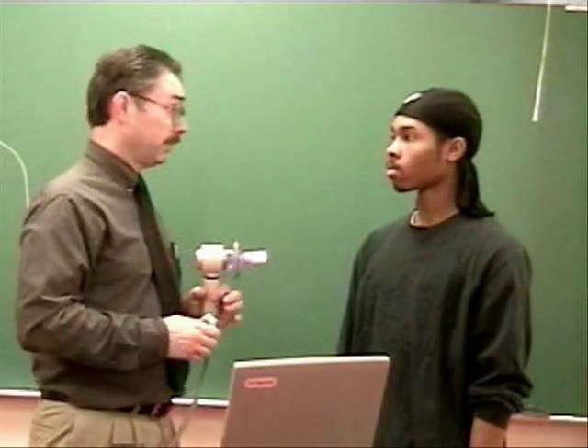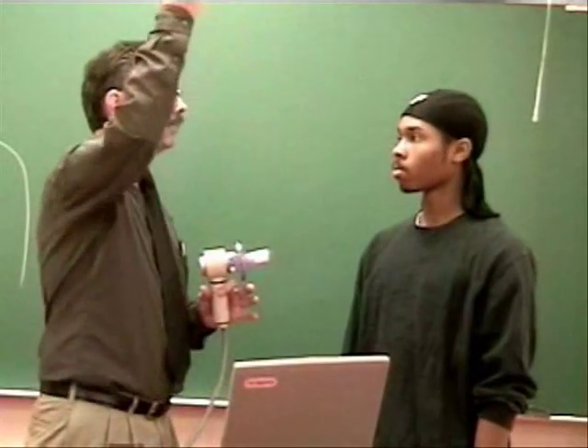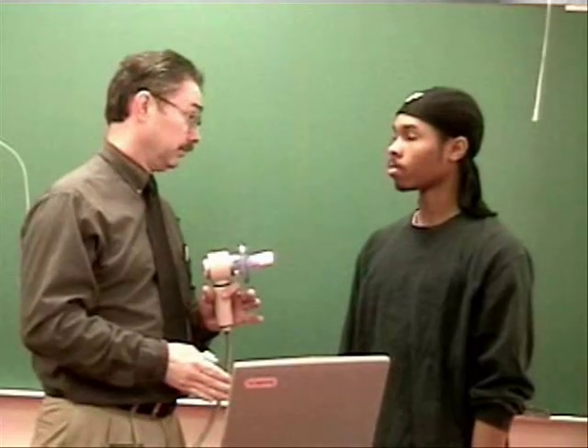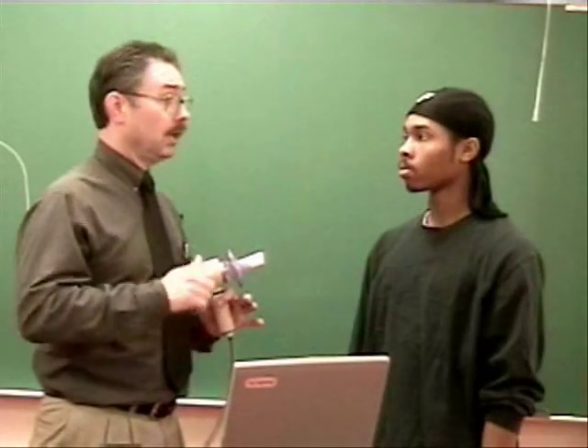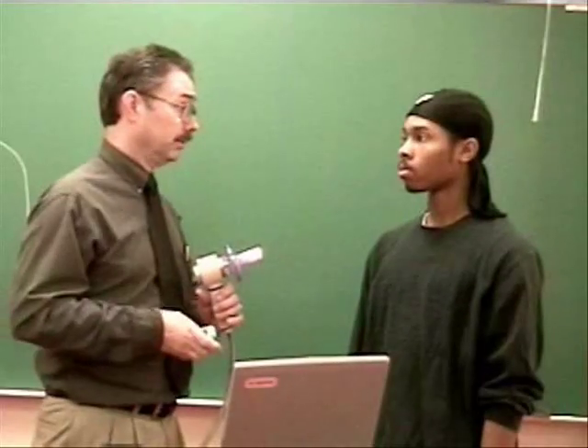Hey now, this test we're going to do is forced vital capacity. That's where I'm going to have you take in a great big deep breath in, then blast it out as hard and as fast as you can. Just keep pushing until I tell you to take a breath in. Big breath, fast out, another big breath in, okay?